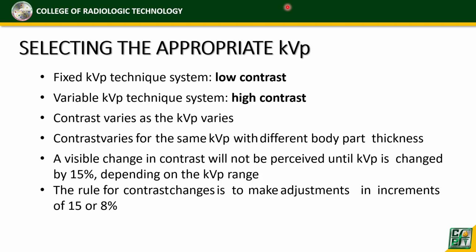Ano ba ibig sabihin ng fixed KVP technique? Okay, variable. Very good. So, ito ay technique or system na nakapix lang yung KVP at ang ginagalaw natin ay MAS. Nakapix lang siya sa isang value. Okay? Pag sinabi yung variable KVP technique, so ginagalaw natin yung KVP. Okay?